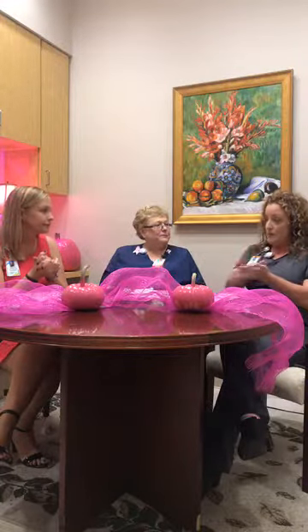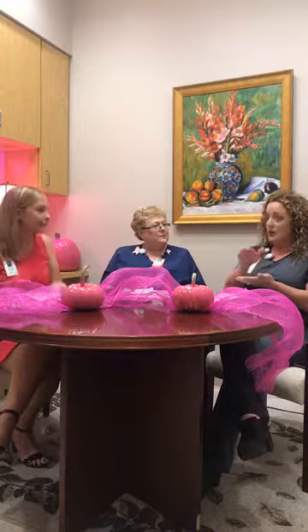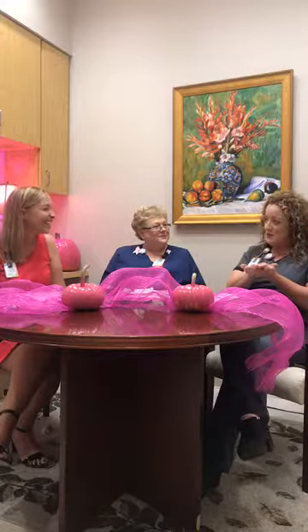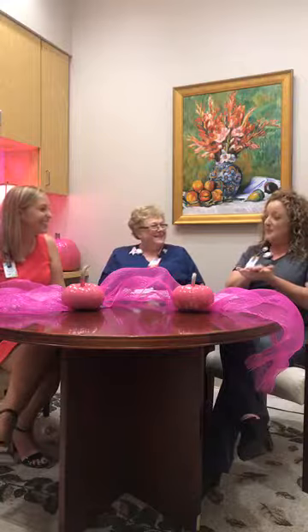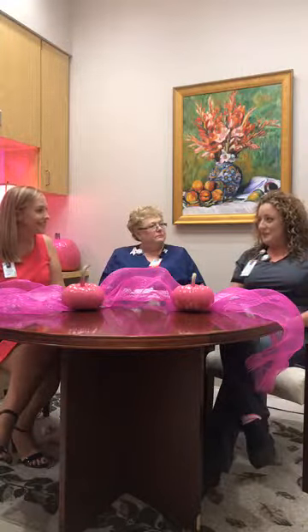We compress. We tell you to hold your breath, and after you hold your breath, the exposure's made. The minute the exposure's over, the machine releases. You're not trapped. You're not stuck. My job isn't to put you in there and hold you for 20 minutes. That's not what we do. But yes, you're going to hold your breath, and once you're released, you breathe. You step back, and a normal mammogram is going to be four images, 2 of each side. Occasionally, you're going to do more images, but for the most part, you're going to go in with 2 images of each breast, and it's tolerable.